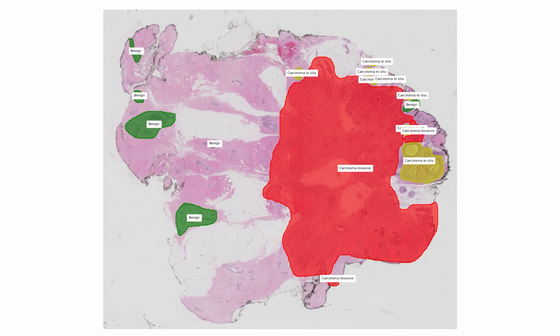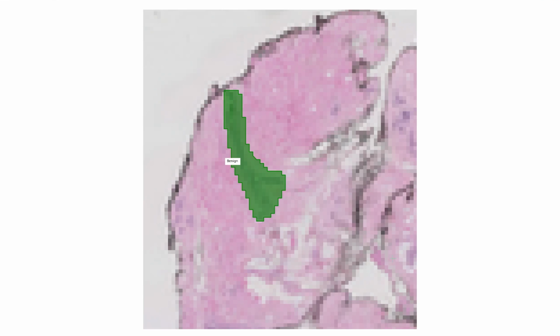So let's assume that we need to work on a specific region. Let's say I need to work on the benign region here. So in this case, we need to extract that region specifically in a high resolution manner. Because in thumbnail, if we zoomed in, it has a bad resolution. There is no details. And as mentioned, the thumbnail is just for viewing and validation and ensures that the annotations are correct or the whole slide image is loaded correctly. So what to do to extract this region or any other region at a high resolution?